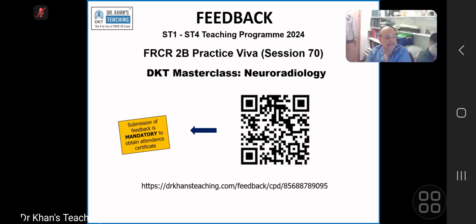In the cervical spine cavernoma, it was a very dense hemosiderin rim, so not ependymoma in the differential. But you won't be penalized as long as you say mass effect and all, and spinal surgical referral.